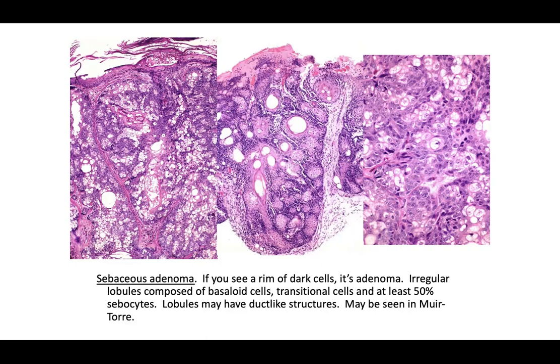Of course, you can see abundant sebaceous neoplasms in Muir-Torre. The IHC that you want to make sure that you know are 4 different types of proteins that are stained for, and if you see a decrease in one of them, then you could consider that it may be consistent with Muir-Torre. MLH1, MSH2, MSH6, and PMS2.